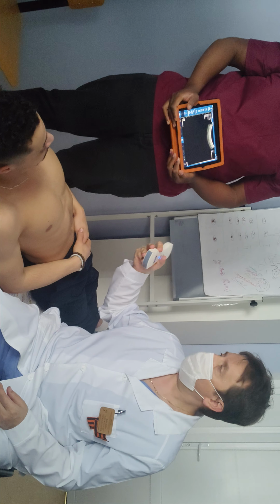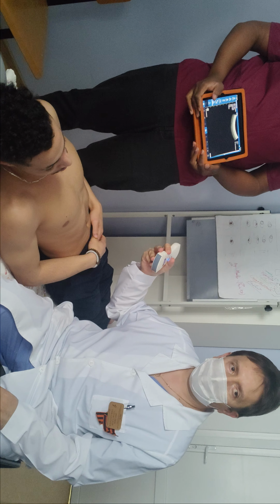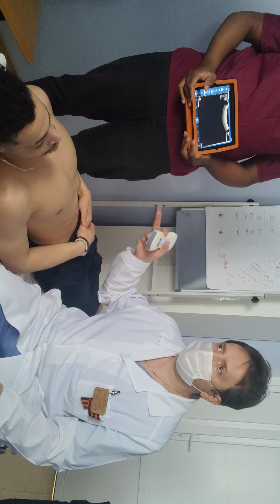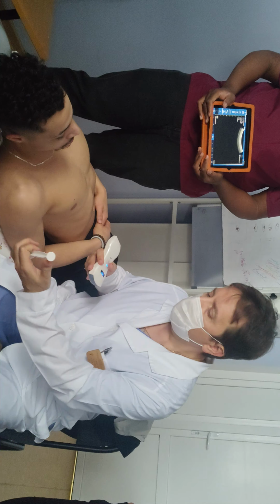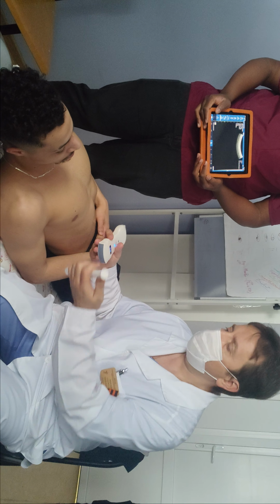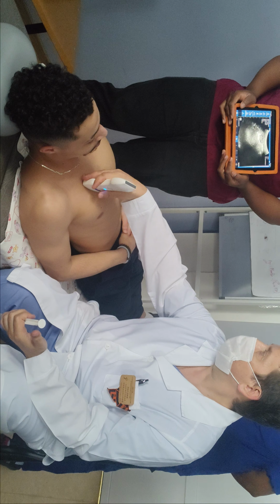Here we have a screen. It is a mobile device, that's why we have the device for fixing the screen. What we shall do, what you will do, pardon. First, several drops only of water. You will put it here and try to find out that picture.